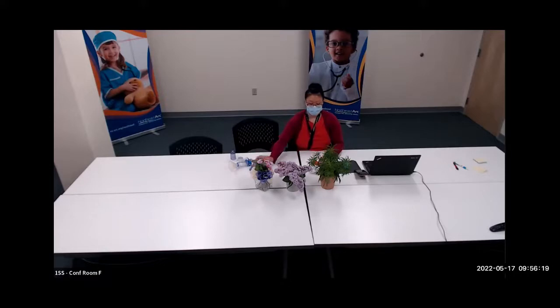Now, some of your clients may have something like this. It's an MDI, it's an inhaler too, but this is Symbicort, for example. The canister does not come out. Even if you try to pull it out, it doesn't feel like it comes out. This albuterol inhaler, for example, comes apart very easily. This one does not. And if you feel any resistance, chances are this is a type of inhaler that does not come apart.